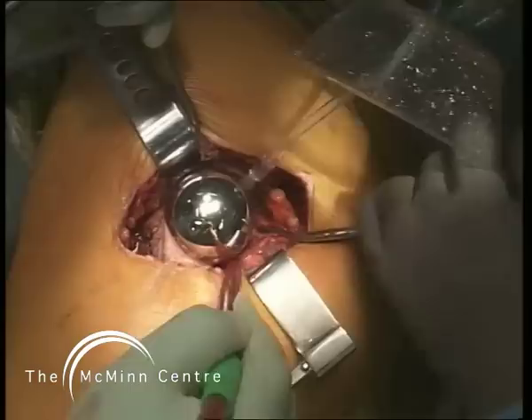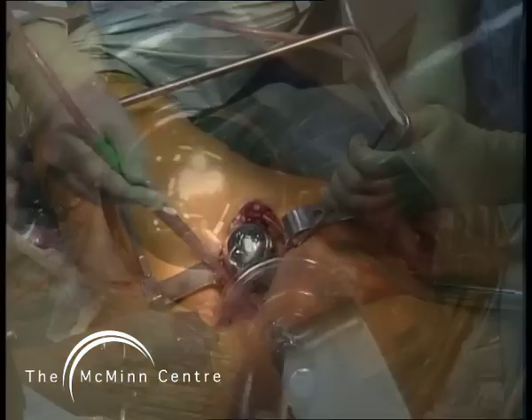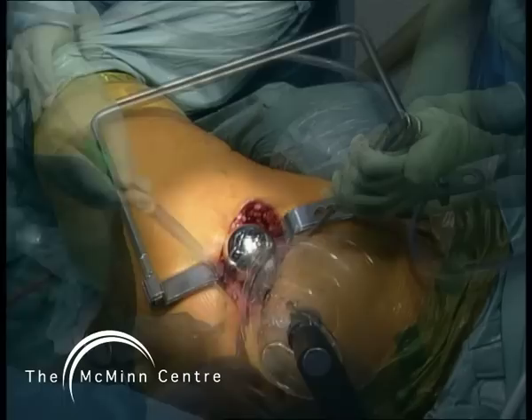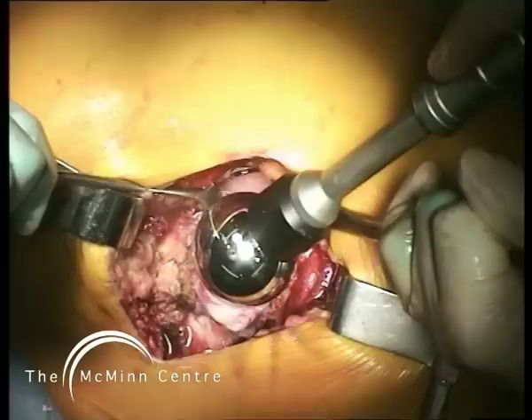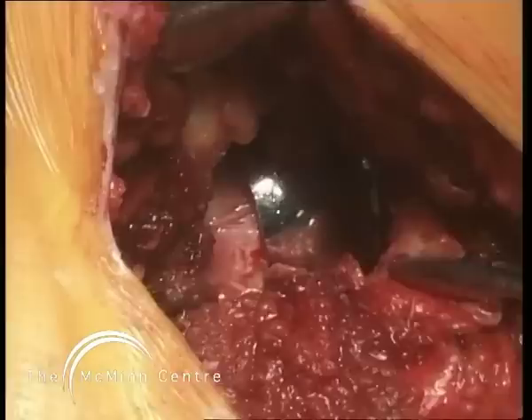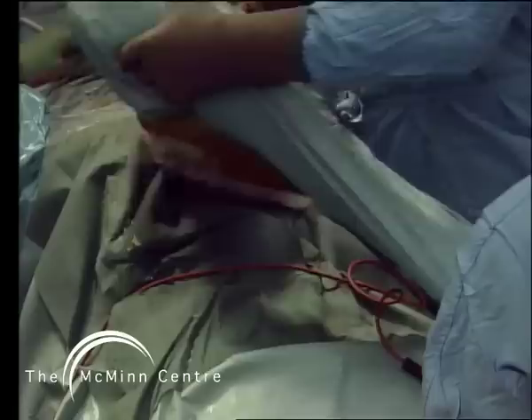I'm now doing final lavage with saline-soaked swabs. You can see saline with fat and marrow displaced into the femoral shaft being sucked out of the vent and into the suction bottle. We want to get rid of all that displaced fat and marrow before releasing the twist off the femur and femoral vessels, because then it will be in the general circulation. I'm cleaning the acetabular component to make sure there's no retained bone debris or cement — there isn't. I'm filling the acetabular component with saline; when the femoral head is reduced into it, the splosh of saline takes any soft tissue out of the acetabulum and prevents soft tissue getting caught between the femoral head and the acetabular component. We're now doing a range of movement check, stability check, and impingement check — and happily all three in this man are entirely satisfactory.